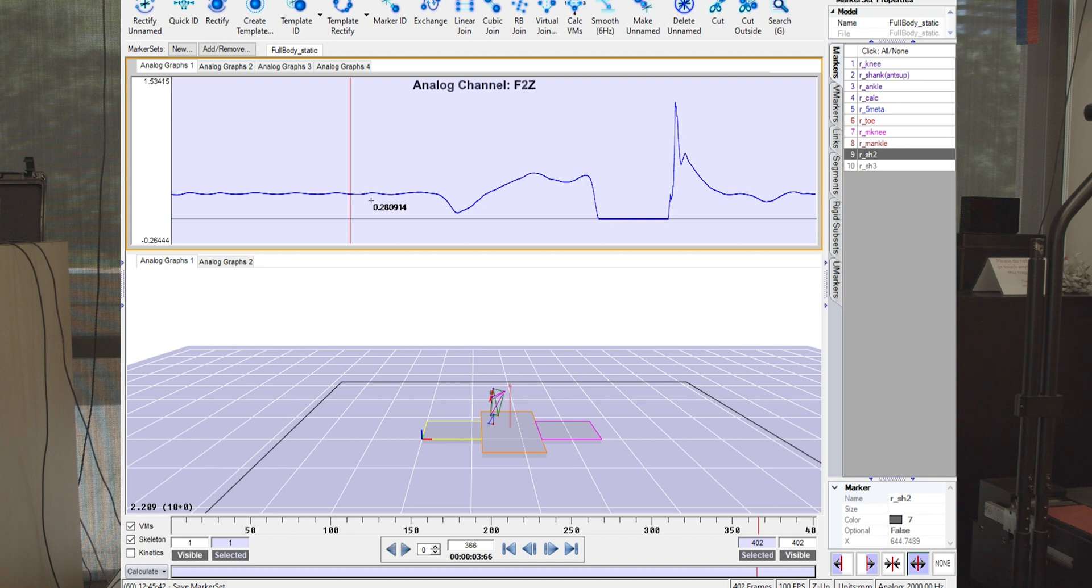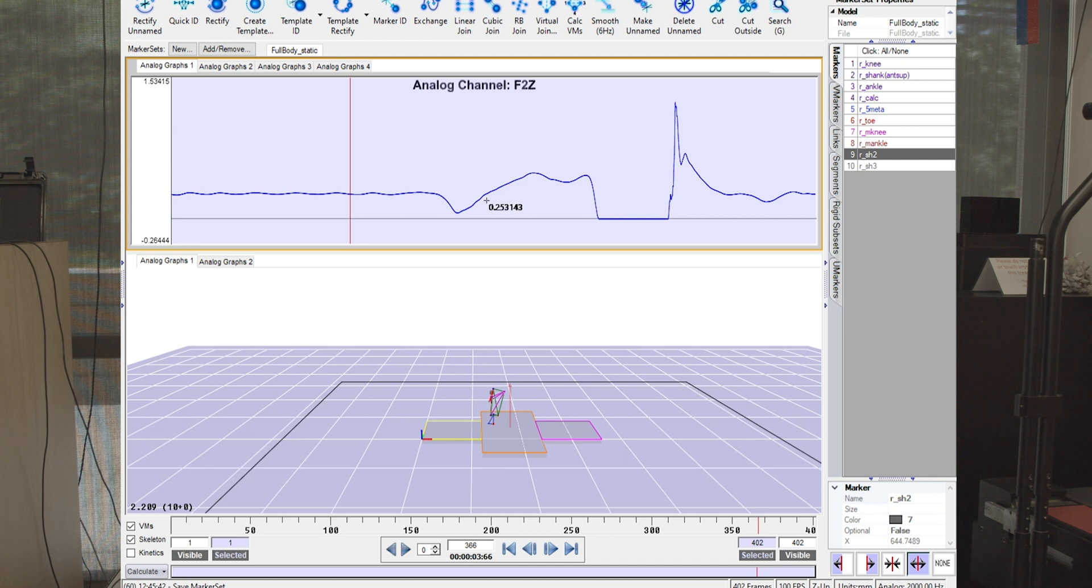And then during the counter movement, you'll actually see the force dips down to about a third of her body weight as she's accelerating downwards. And then as she starts to push off the ground, we see the force go up to multiple times her body weight.